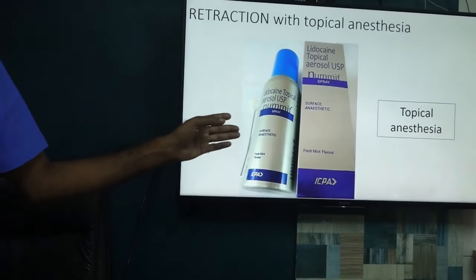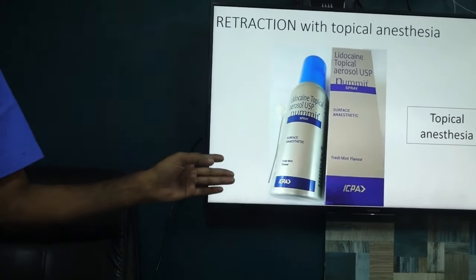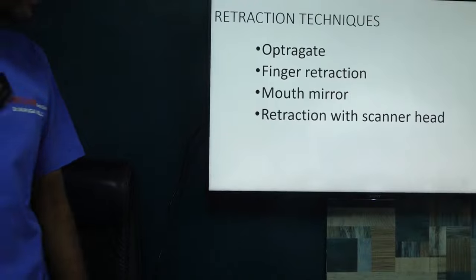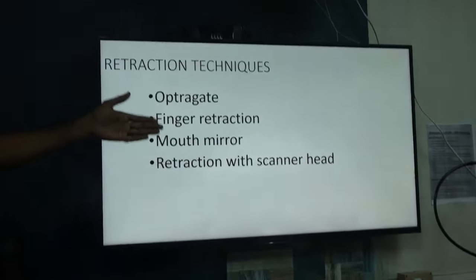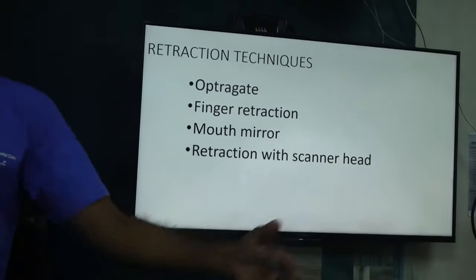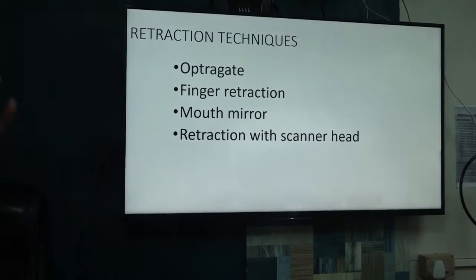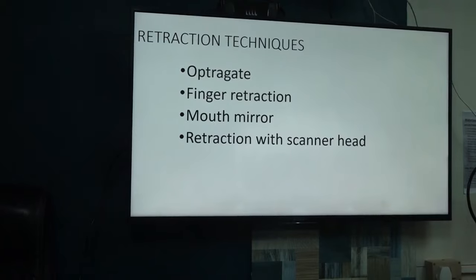Topical anesthetic, it is better to use the spray. Previously we used to use Mucopain, but the spray is much better. Okay, so retraction. This is the most important step, retraction. Definitely we have to use a combination of finger retraction, mouth mirror retraction, and retraction with the scanner head itself. So, four kinds of retraction. Only if you use all these things will you get a correct scan in 1.5 minutes. Our goal is a correct scan in 1.5 minutes, that's it.